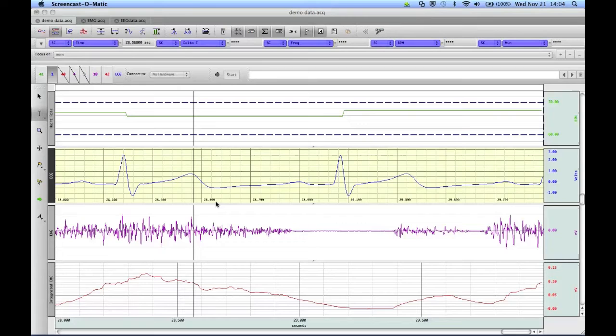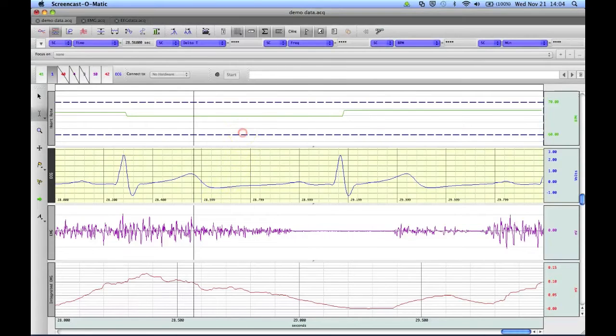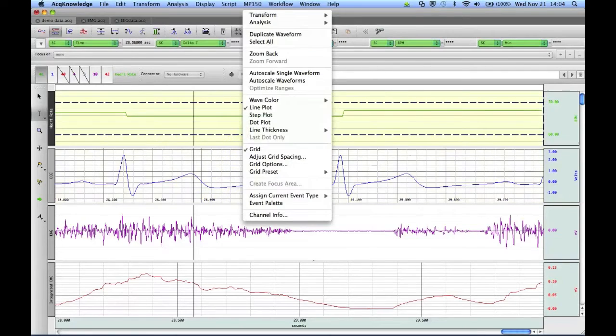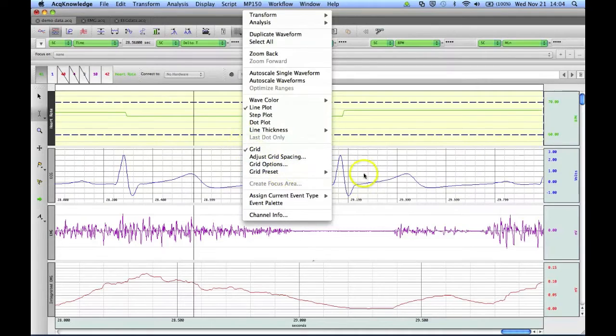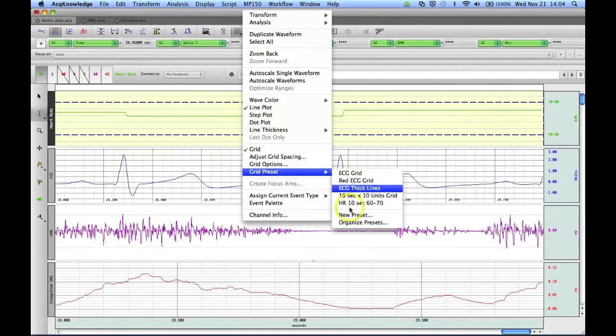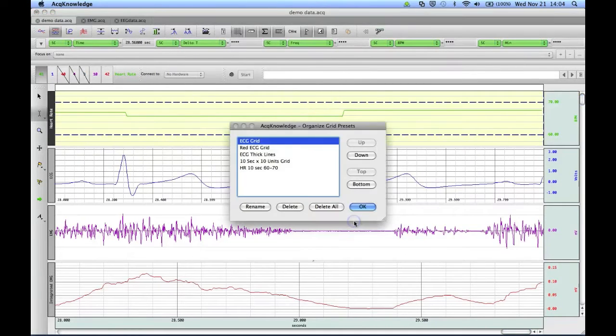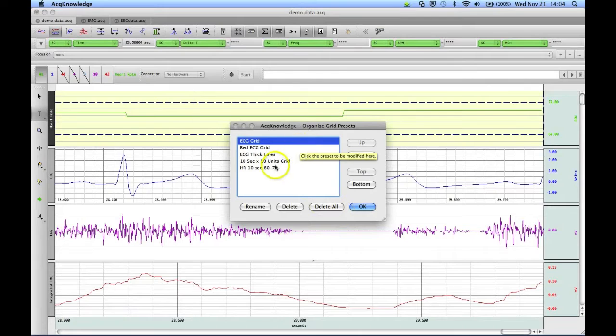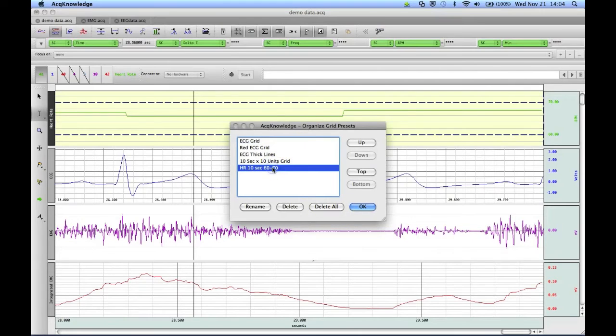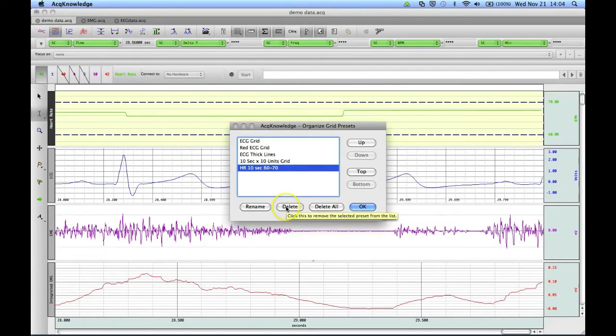If you decide you no longer want a specific preset you've created, you can right-click, go to Grid Preset, go down to Organize Presets, and from here, you can select the one you no longer need, and delete it.